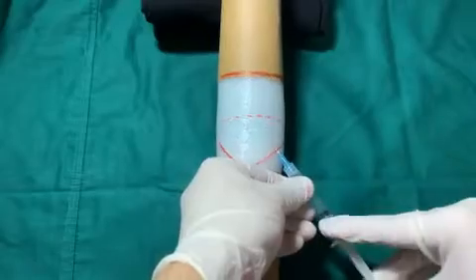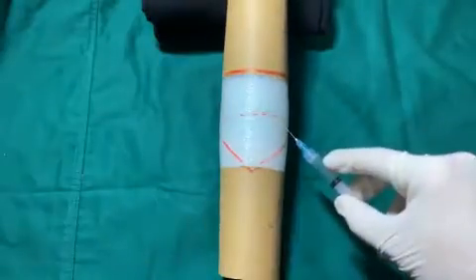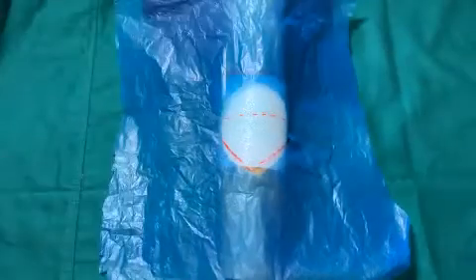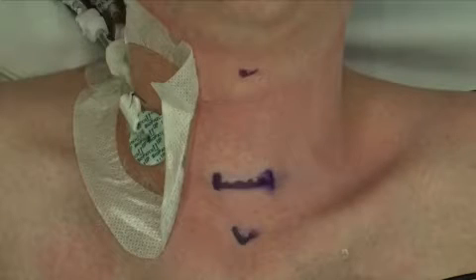Unless the patient can be safely intubated or the patient can be ventilated with a mask, a tracheostomy should be done under local anesthesia. Drape the neck. If the tracheostomy is done under local anesthesia, the face can be uncovered. The tracheostomy is created below the first tracheal ring to avoid subglottic stenosis as a result of scarring.